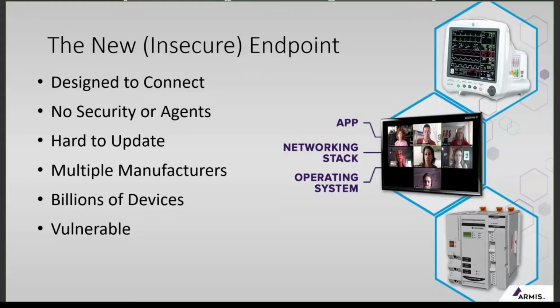They're built to do the thing that they were built to do. So security practitioners, IT resources, anyone within an environment that would traditionally be installing additional software to detect and respond to attacks on these devices just doesn't work in this landscape. These devices don't allow software to be installed, and in many cases, if they do, which is very few, in these scenarios are few and far between, that software can be incredibly problematic, can actually cause these devices to fail.